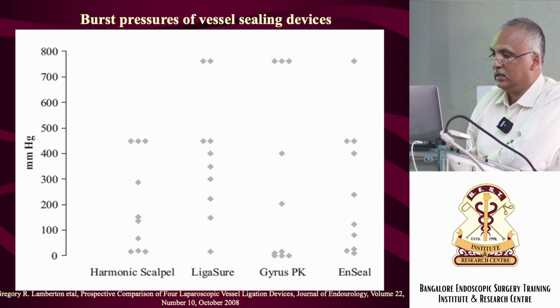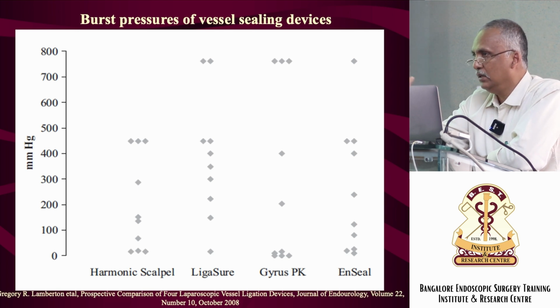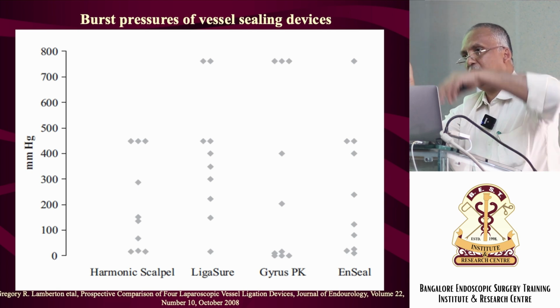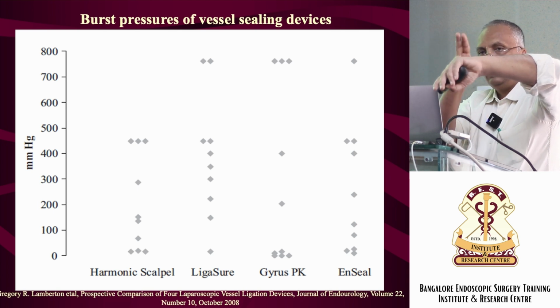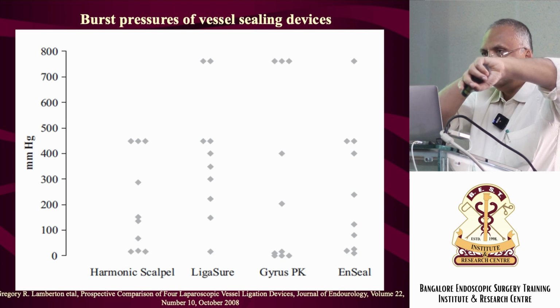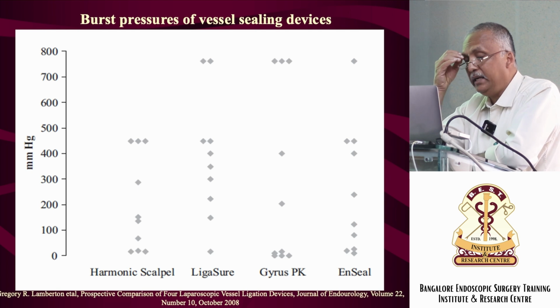along with carbon dioxide. So carbon dioxide is non-contact, it is like a laser beam which goes and cuts. But when you are using that, after cutting something it will go and cut something else. So what you should do is you must keep an instrument behind it. You have a broad ligament, you have a round ligament, or behind it you keep a 5 mm instrument and cut it exactly on that. Then it cuts beautifully without causing any bleeding.